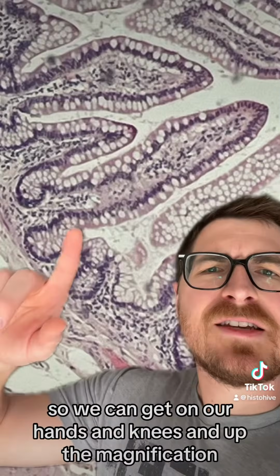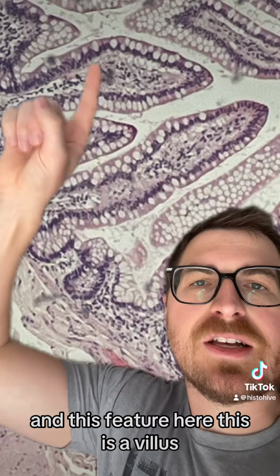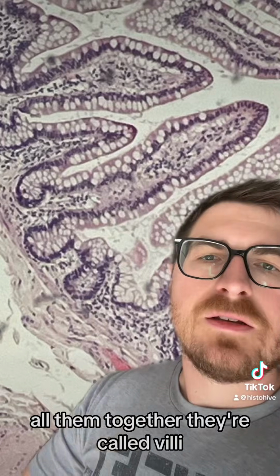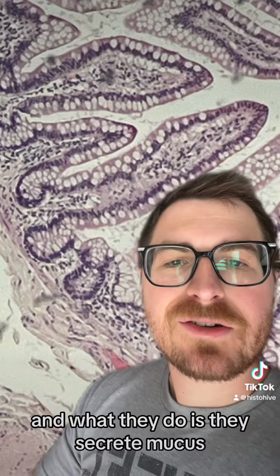So we can get on our hands and knees and up the magnification to look at this mucosa a little more closely. So this feature here, and this feature here, this is a villus, villus, villus. All of them together, they're called villi. Small intestine and the mucosa also has goblet cells. So all these white cells are goblet cells, and what they do is they secrete mucus.